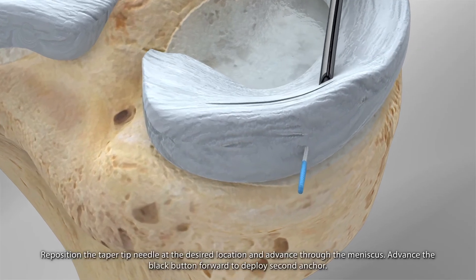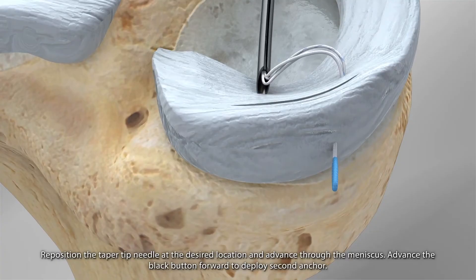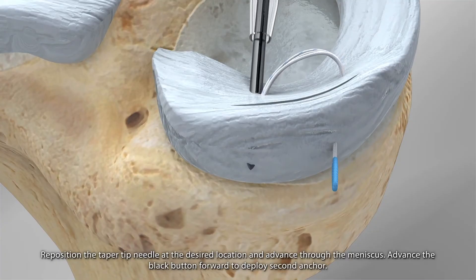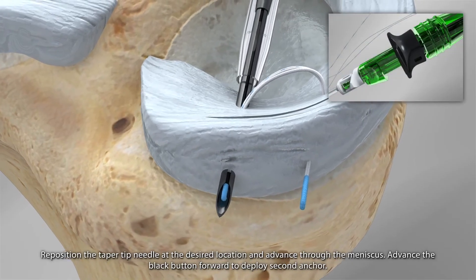Reposition the taper tip needle at the desired location and advance through the meniscus. Advance the black button forward to deploy the second anchor.